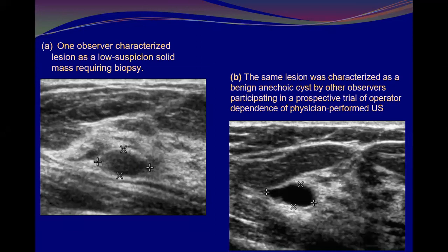If you are talking about the focal zones, it will affect the focalized area. Now you are talking about the TGC, the grayscale, the dynamic range.